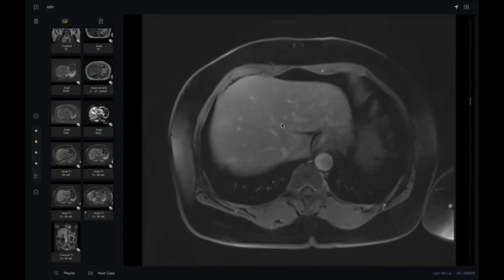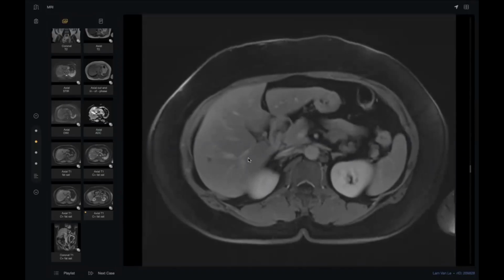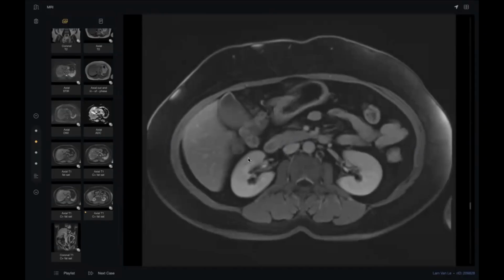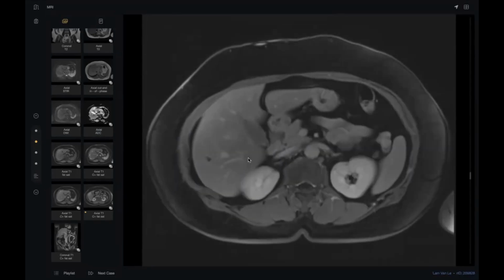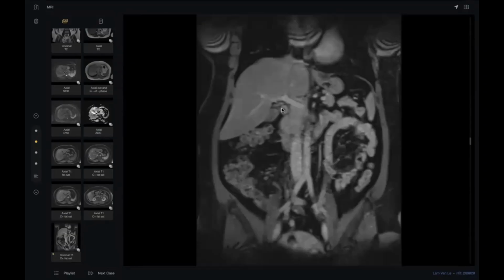By the way, when you suspect an injury of the biliary duct, tell the examiner, I will give Primovist and I will wait 60 minutes. Why? To give a good chance for excretion of the contrast. If the biliary tract is injured, what will happen?